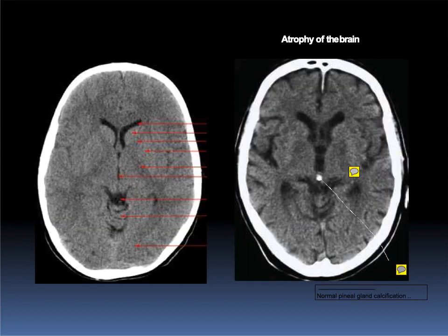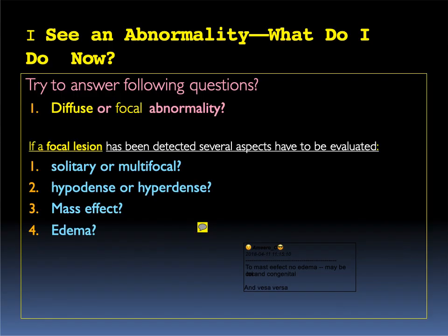So on your left is a CT scan of a normal patient. On the right side, check the ventricles dilated and the sulci dilated. You will detect some dilatation, or the beginning of brain atrophy, which is a compensatory dilatation of the ventricles. We have a classification, which is common and not important. So we have to detect the abnormalities.